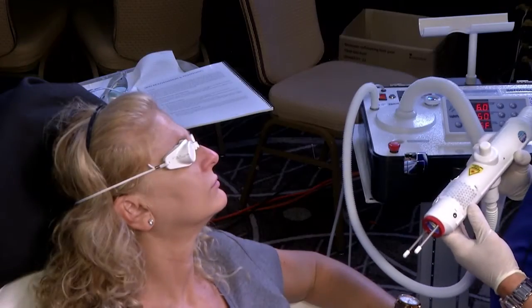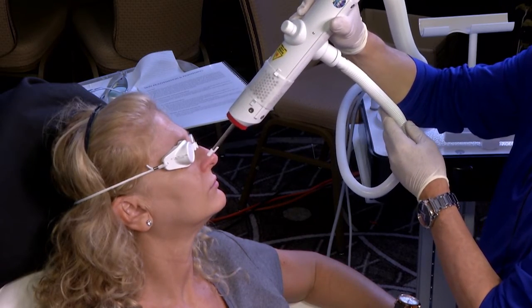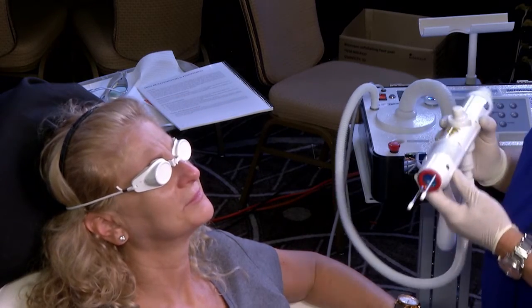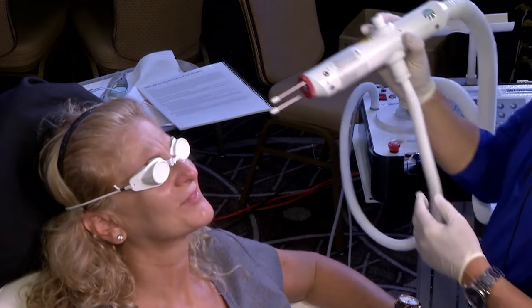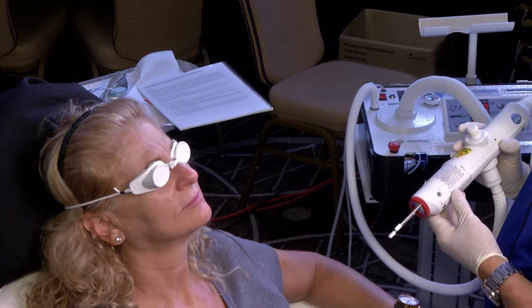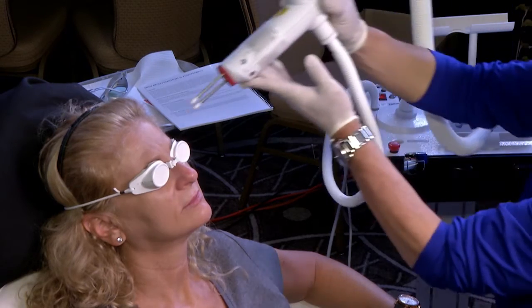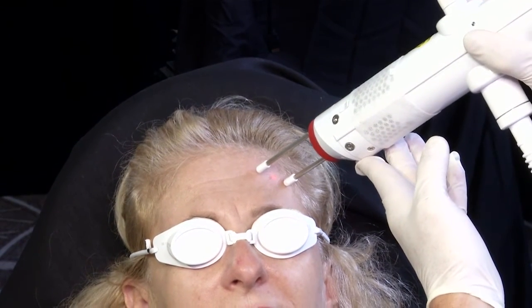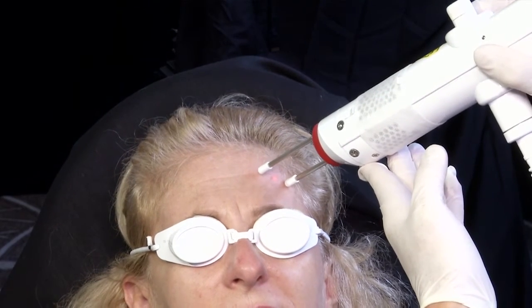I've done this in one treatment and up to three. All I'm doing is getting a little vasoconstriction. That's treating the telangiectasia. Now for a solar lentigo — in the office I call them experience spots, we never call them age spots. It's really the same approach, except the goal is to get some darkening of the lentigo, much like you might with an IPL. I'm going to hit this several times at the same distance with the spacer. She feels that a little bit because it's a much higher fluence. It's a tad darker. So you can treat dark hair, give neocollogenesis, treat lentigines, telangiectasias, and if she had acne, which she doesn't, it's a terrific approach to acne as well.